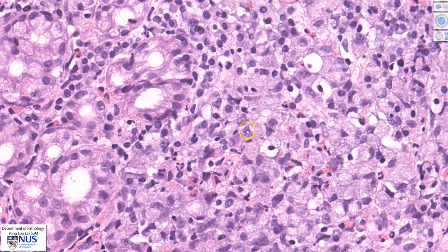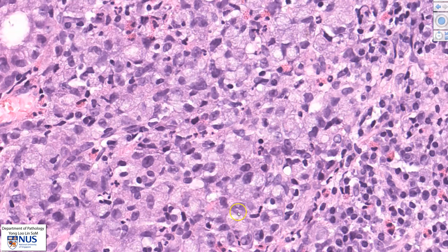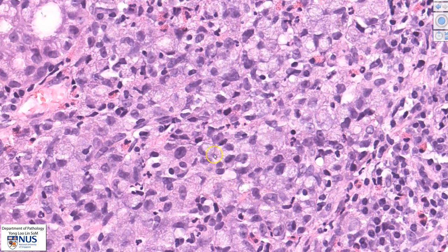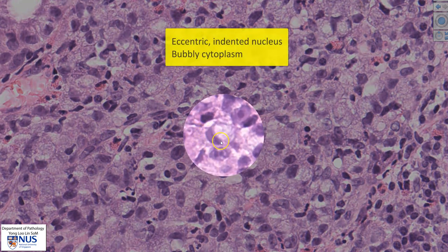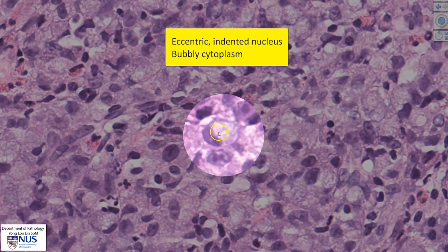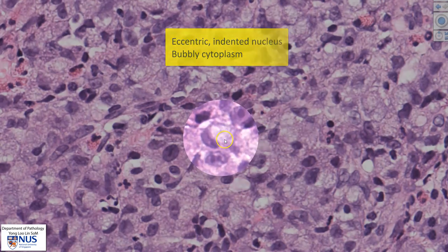The malignant cells have prominent nucleoli. Focusing on one cell, the nucleus is very eccentric — it is literally touching the cytoplasmic membrane at the edge of the cell, and is indented by the cytoplasm. The cytoplasm appears somewhat grayish and bubbly.